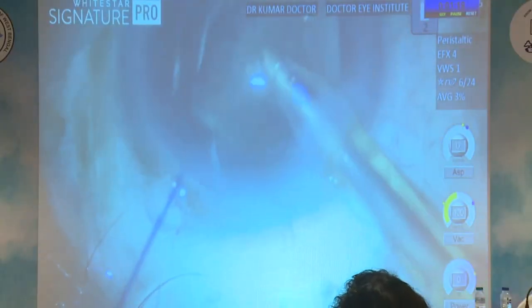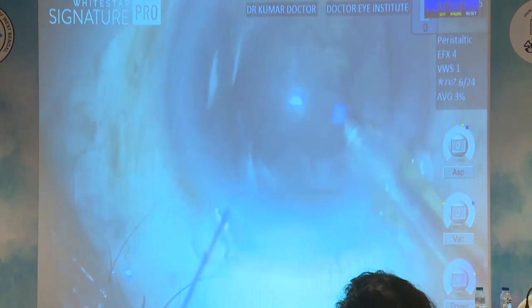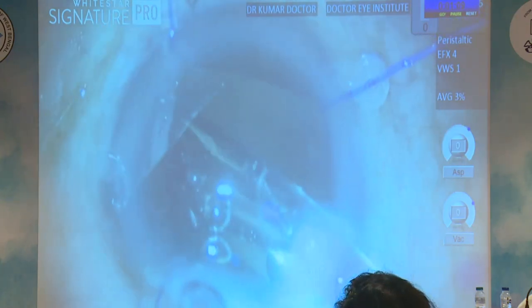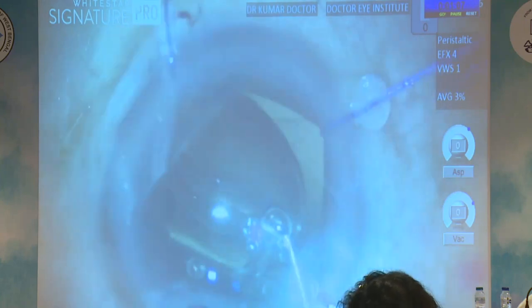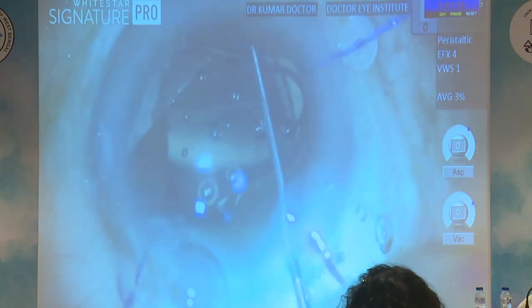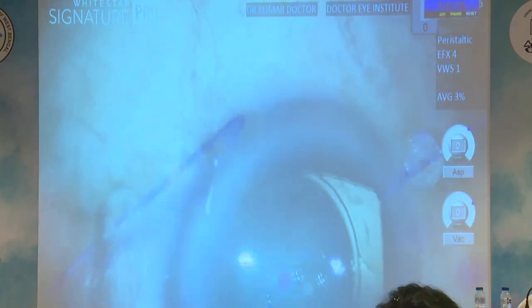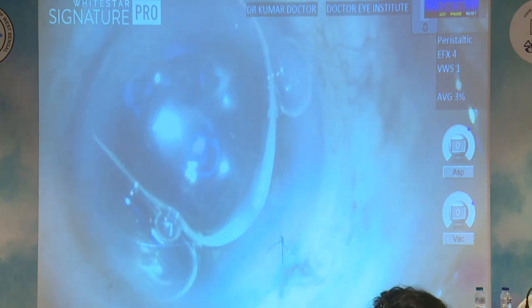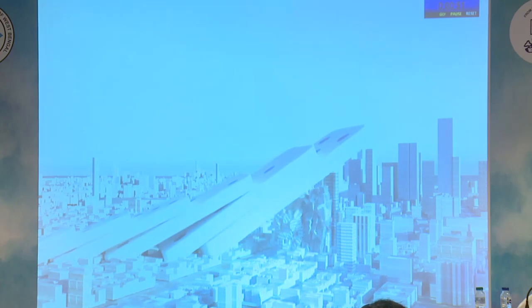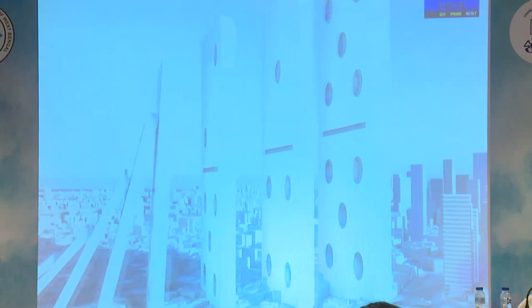Changing the direction of the phaco tip so that the fluid passes down underneath the epinucleus, it popped up, and then we performed an IA and inserted the lens into the bag. In this case, we did not feel the need to increase the size of the lenses. 5.5 was enough. Then we removed the hooks carefully and we took a suture just to be safe because the iris was quite floppy in this case. So the dominoes which had fallen in the previous case, we managed to get them out.